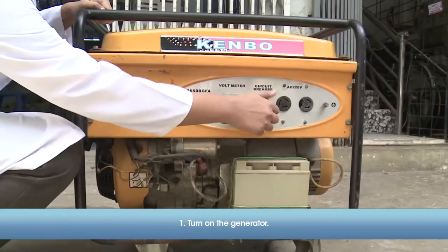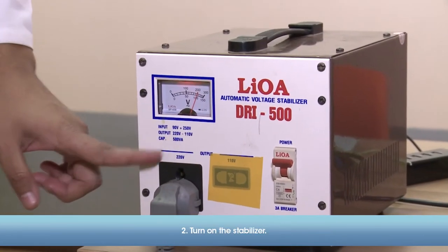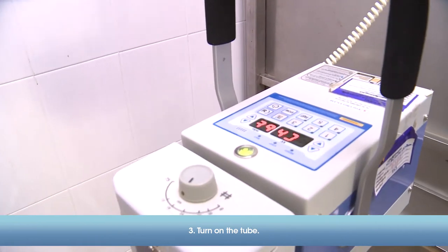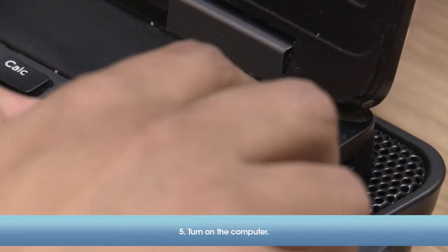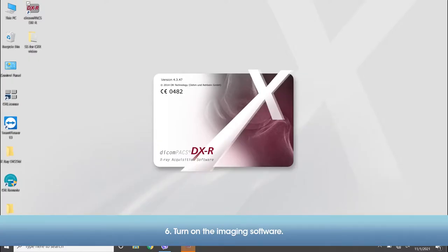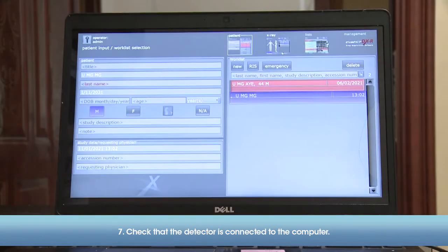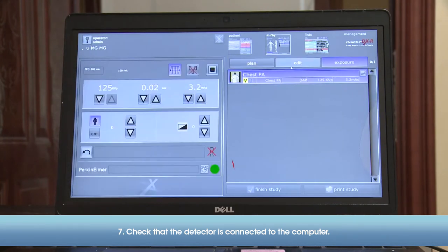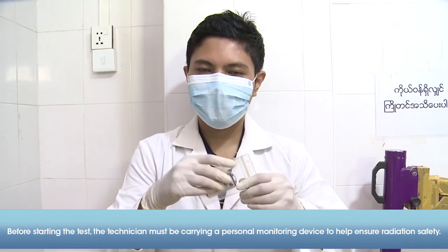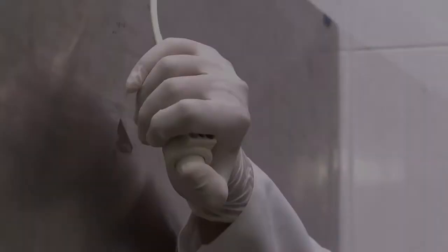Then, follow these startup steps: 1. Turn on the generator. 2. Turn on the stabilizer. 3. Turn on the tube. 4. Turn on the detector. 5. Turn on the computer. 6. Turn on the imaging software. 7. Check that the detector is connected to the computer. 8. Lastly, test the machine in advance to ensure it is working properly.